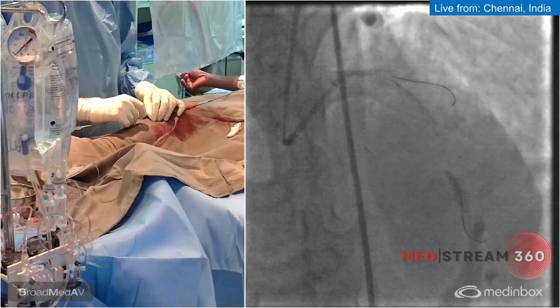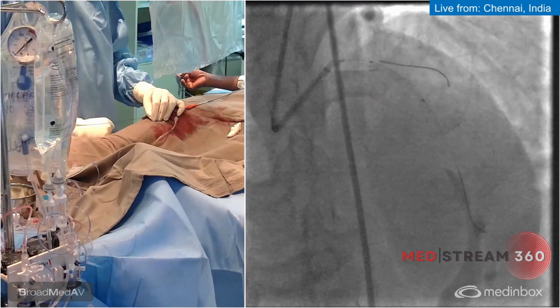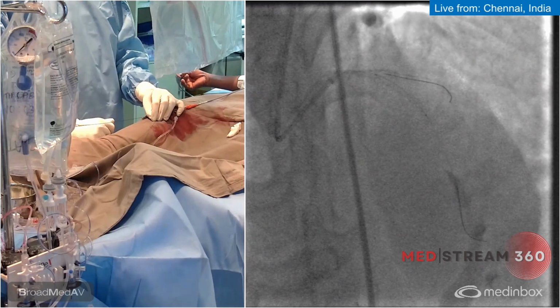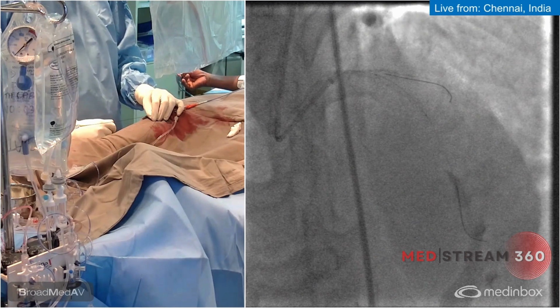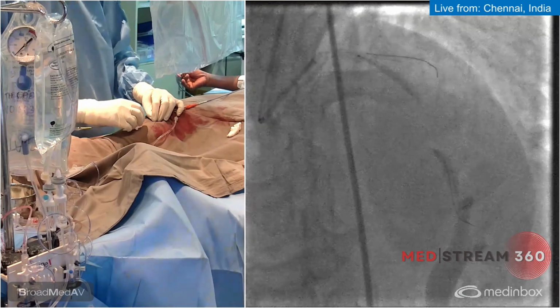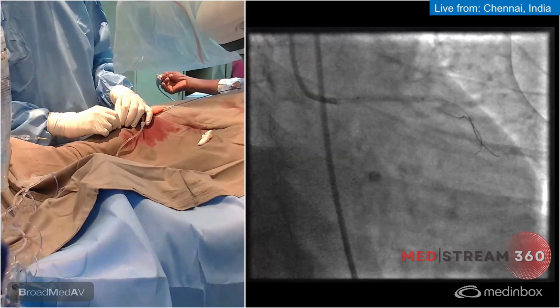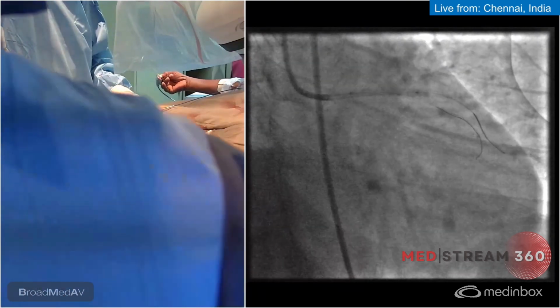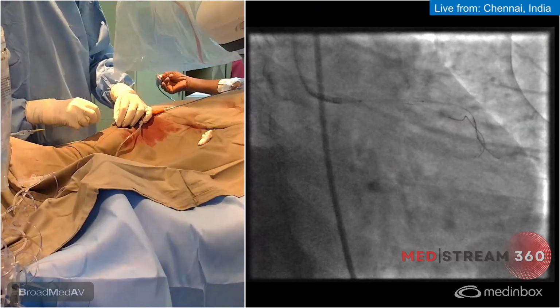Deflate, please. So we got that open nicely now. I'm going to come back with the balloon and go up there. High pressure, please. And so we've decided now that since the disease is extending into the ostium of the left main, we're going to touch the left main here, okay? So you can see here that this is exactly with a few millimeter overlap. Maybe we don't need a 30. We may need a little less, maybe 26 or something.